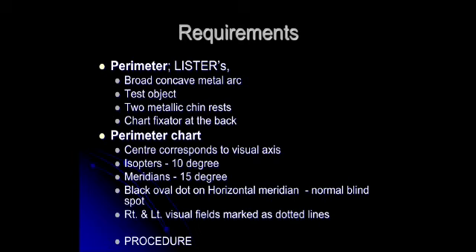The blind spot is marked along the horizontal meridian in the temporal quadrant by marking the point of disappearance, bringing the test object towards the center after initial appearance in the field, and the point of reappearance with further movement of the object. This gives an idea of the size of the blind spot. Repeat the whole procedure in the opposite eye on the same chart. Observe the obtained field of vision and compare it to the normal visual field depicted in the chart. Note the size and site of the blind spot.